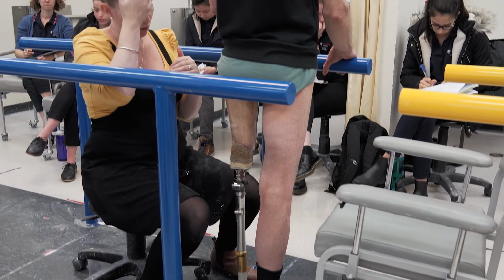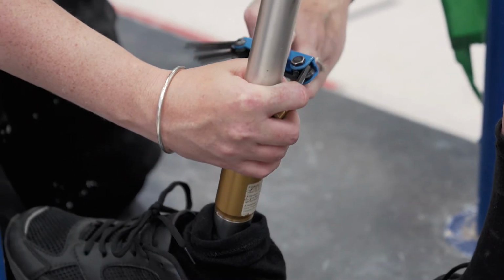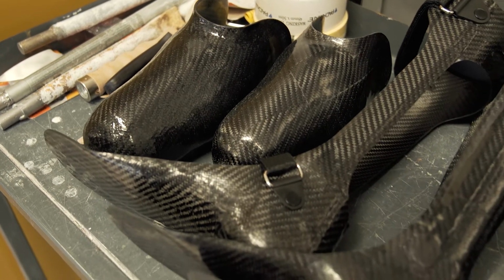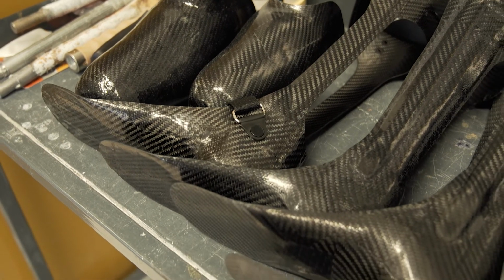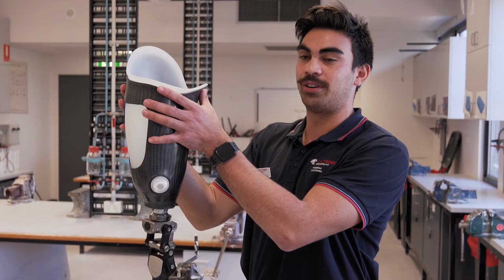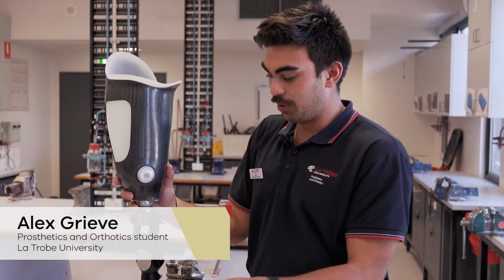Then eventually the client will come back in, we'll fit the prostheses and see how that's working out. Now generally it's not a one-time, it fits and it's perfect. Generally it's a lot of back and forth and just trying to figure out with the client what's going to work best for them. We mould this socket, we then go and build it, grind it, make sure it's a perfect fit. And then, for an above knee amputee, we'll order in a knee component and a foot component.